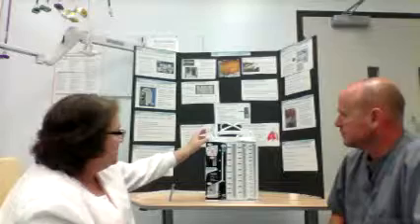If it continues to have problems, sometimes you may have to clamp the chest tube with the system. If you realize that something's wrong with this chest tube system, it's not working correctly, then you probably need to replace it. The best thing to do is not clamp and go get your piece of equipment. Go get another chest tube drainage system and have it opened. Remember, it's going to be in a sterile container. Have it open, get everything ready. Then you want to clamp the tube, disconnect the tubing, and then reconnect everything. That way the patient's only been clamped off for a short period of time.